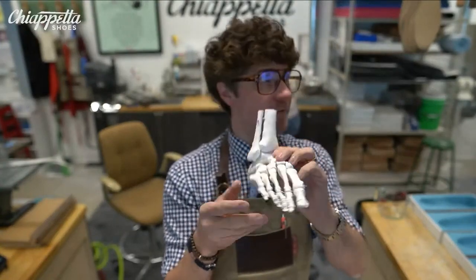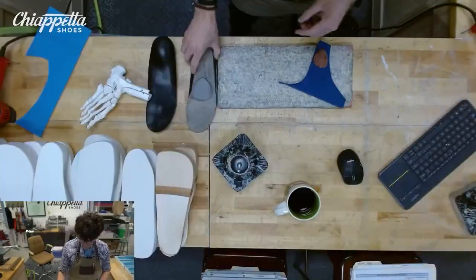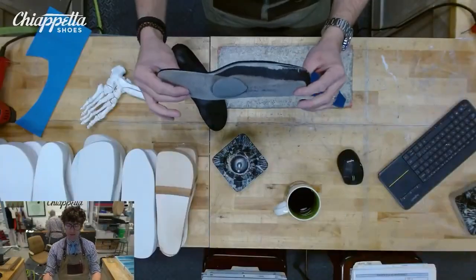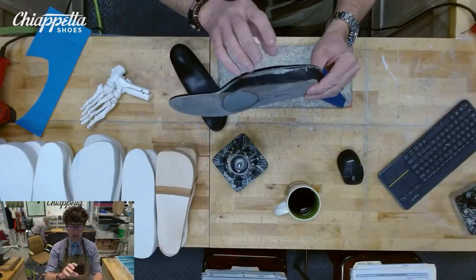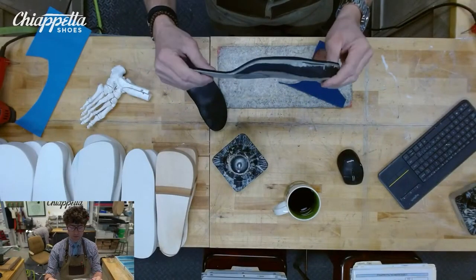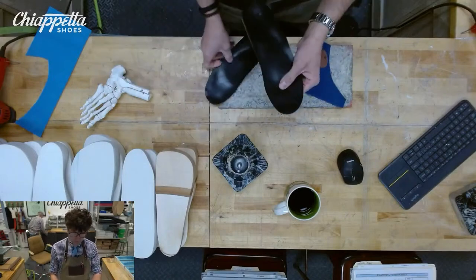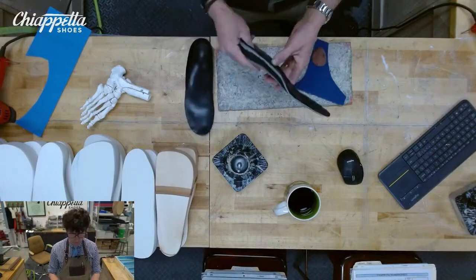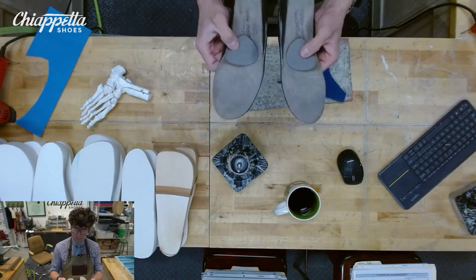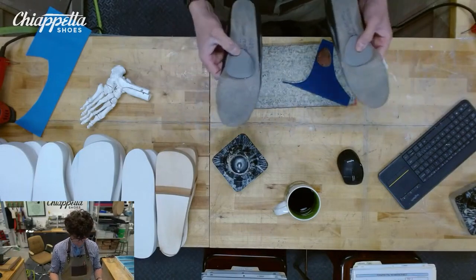Now, B7 foot types, we're going to take you top down. We've had a custom orthotic with EVA, polyurethane, THK, and then a cork compound, multi-cork. It's done pretty well for her. One downside on the left foot, she's developed a pretty significant hammer toe on that second toe there. We had a met pad on there. It was kind of like a larger standard met pad.